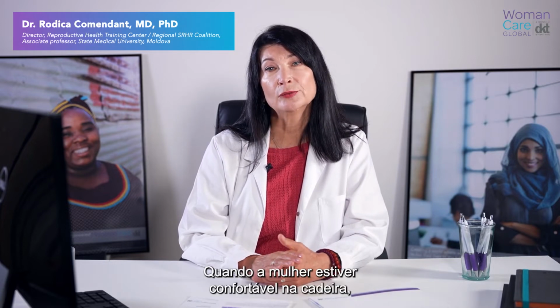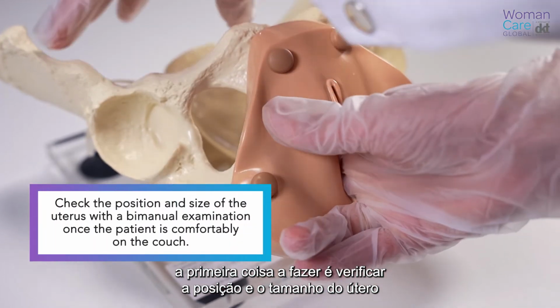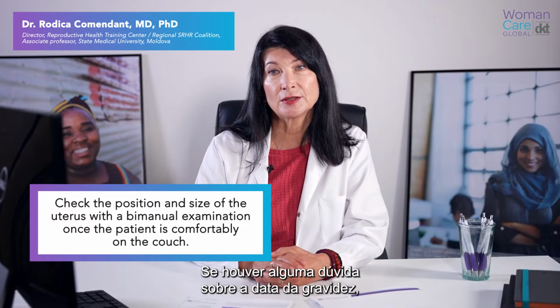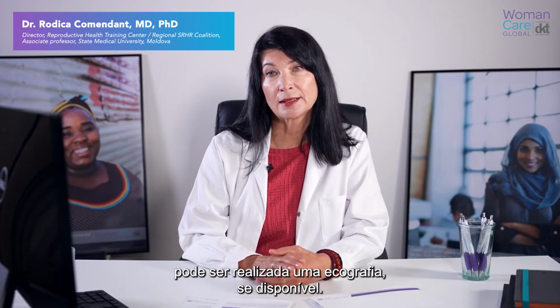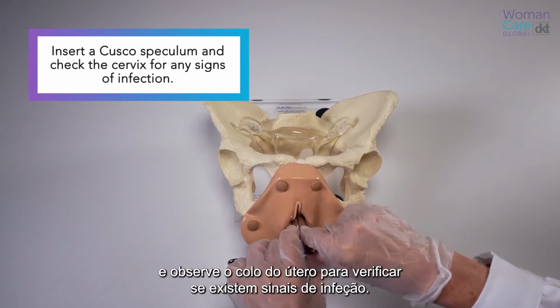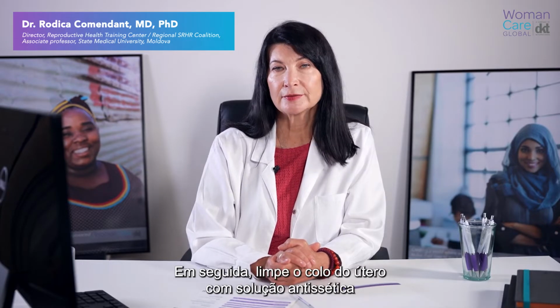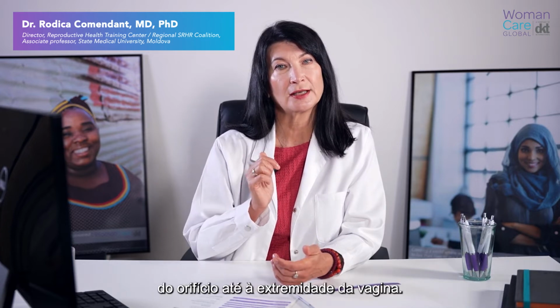When the woman is comfortable on the couch, the first thing to do is to check the position and size of the uterus with a bimanual examination. If there is any doubt about pregnancy dating, an ultrasound scan can be carried out, if available. Secondly, insert the Cusco speculum and check the cervix for any signs of infection. Then clean the cervix with antiseptic solution from the os to the edge of the vagina.